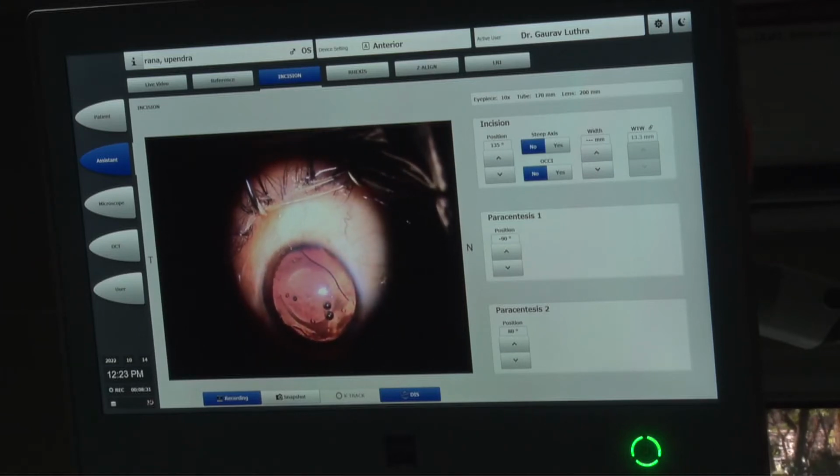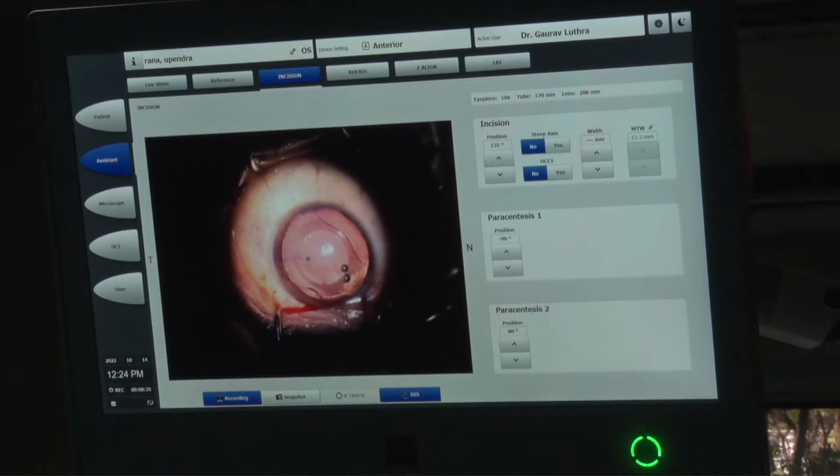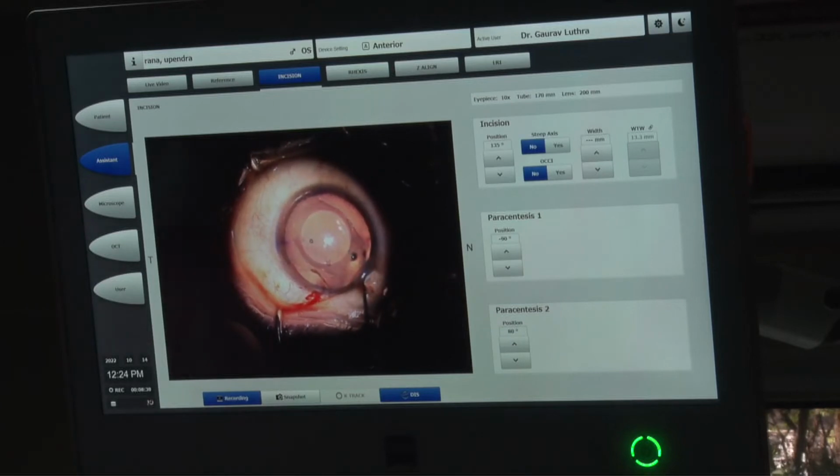We have an intraoperative OCT. So we'll show that once my ICL is positioned. Light mein dekho bete. Light mein dekho. Even the leading haptic has a hole. Yes. So there are several landmarks on that actually. Hole also. So these 2 holes have to be superior, and then the shape of the small holes which are there on the haptics and this small notch over here.